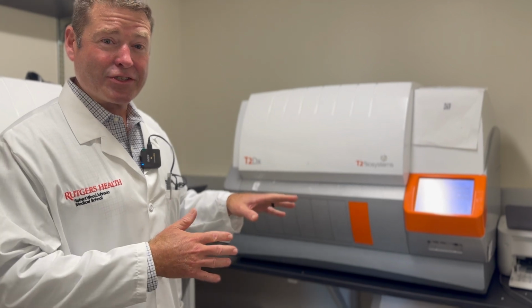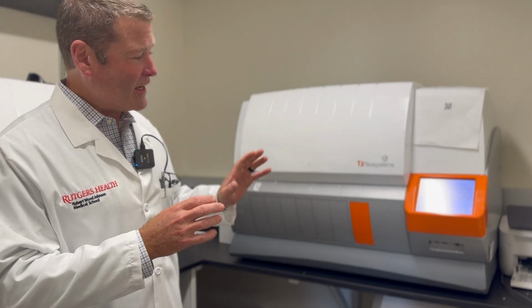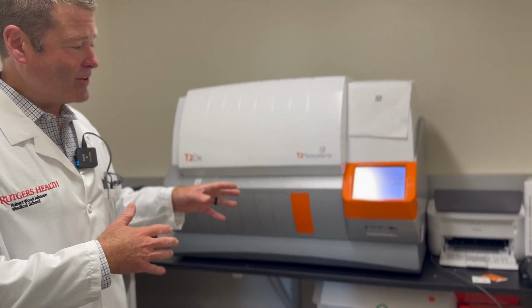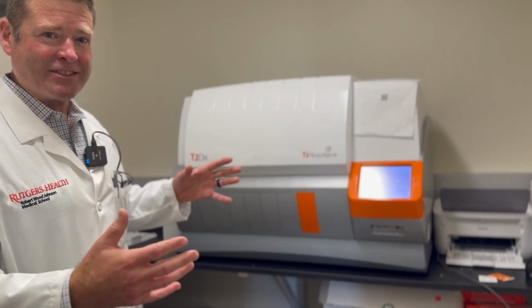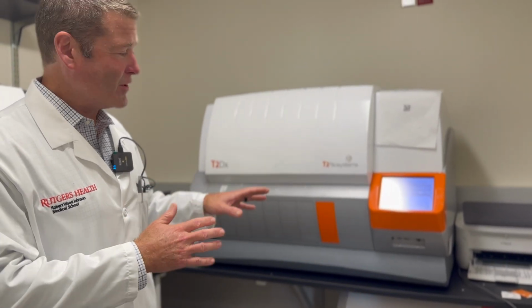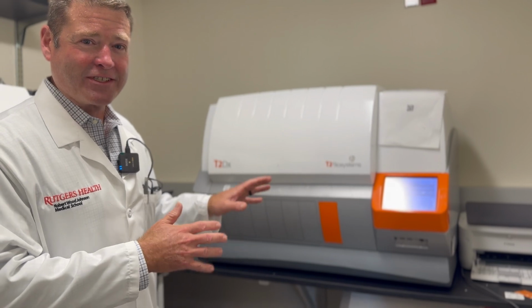And the technology is also really cool. In addition to molecular techniques which hybridize to nucleic acids from those yeasts that are in the blood, it also uses magnetic resonance imaging to detect them. And so this is really state-of-the-art. This is really on the cutting edge of infectious disease diagnostics. Last stop on the tour, guys. We're going to go over to the virology lab and look at our molecular infectious disease testing section. Come on.